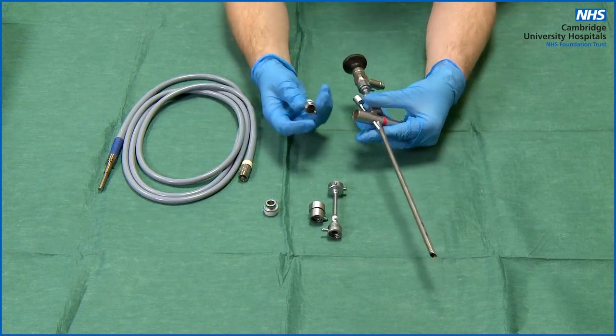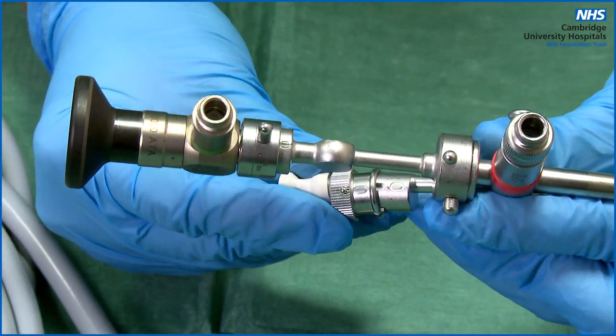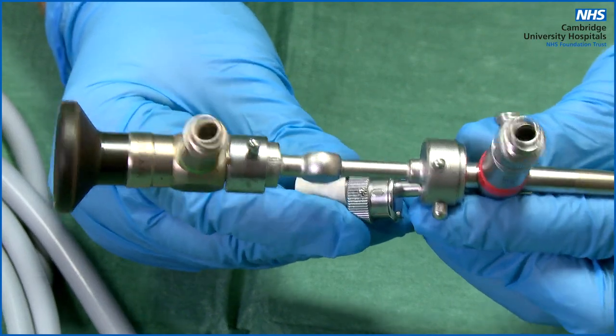On the suction catheter guide, on the side, there is a zero marker. You will need to find the zero marker on the bronchoscope, line the two up, and push together.